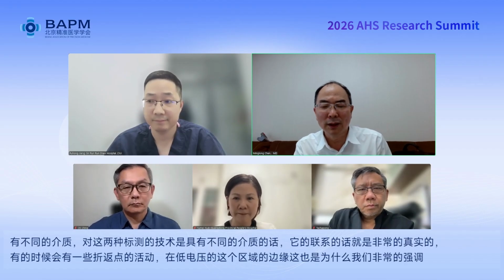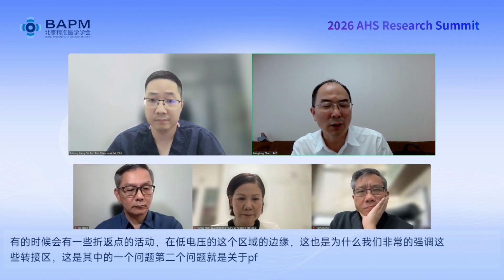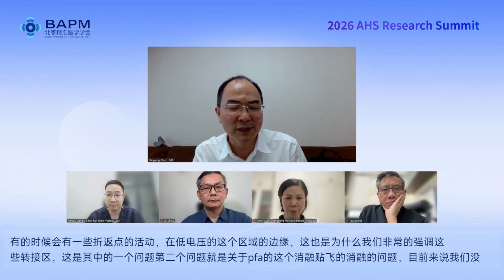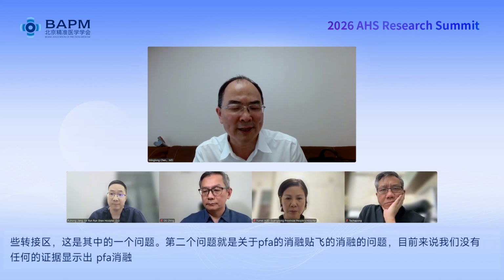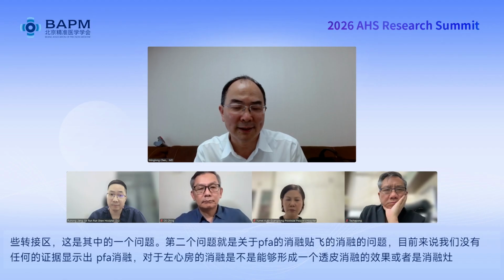The other question is regarding PFA ablation. Currently we do not have the evidence on whether PFA ablation in the left atrium body can create transmural and permanent lesions. So we don't have the evidence. Maybe this is our future study direction.